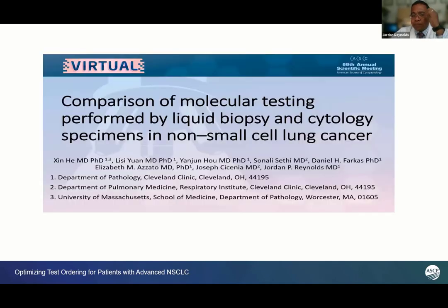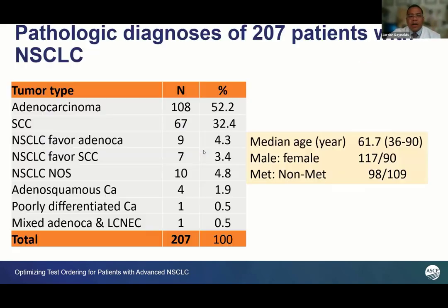Now, I recently, with one of my fellows, did a comparison of molecular testing performed by liquid biopsy in cytology and non-small cell lung cancer. And we're working on the publication now, but I wanted to share some of the data with you. So we had 207 patients that had cytology, molecular, and the liquid biopsy at the same time from a proprietary company, and 108 of those had adenocarcinoma.